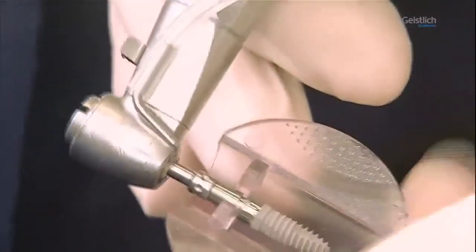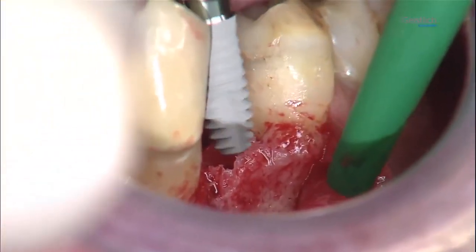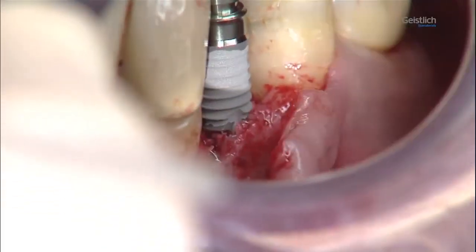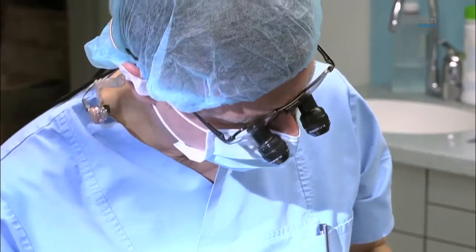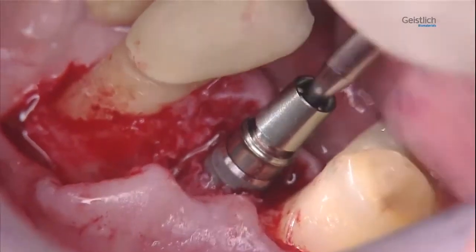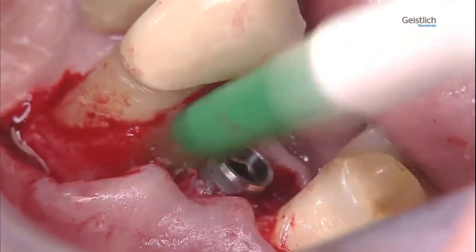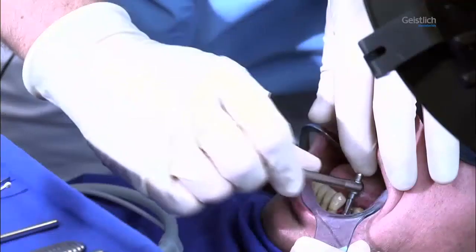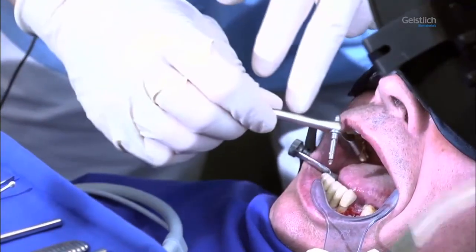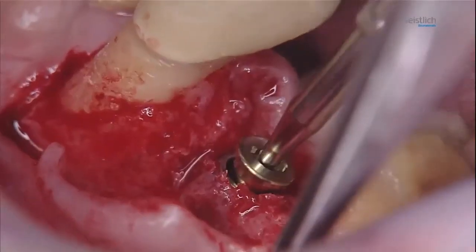The implant and its insertion tool are removed from their sterile packaging and mechanically screwed into the implant bed at low speed, following the implant manufacturer's instructions. We now detach the insertion tool from the implant. Final primary stability of the implant is achieved manually using a ratchet. The implant shoulder is now located just above the bone level. The implant is sealed with a cover screw.